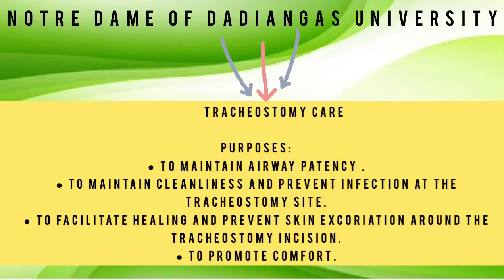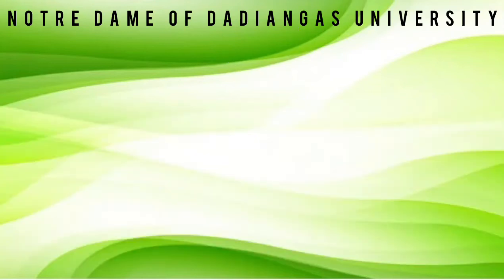The purposes are to maintain airway patency, to maintain cleanliness and prevent infection at the tracheostomy site, to facilitate healing and prevent skin excoriation around the tracheostomy incision, and to promote comfort.